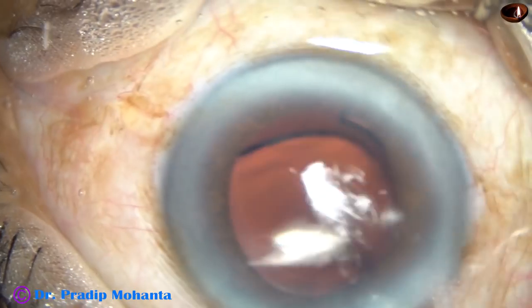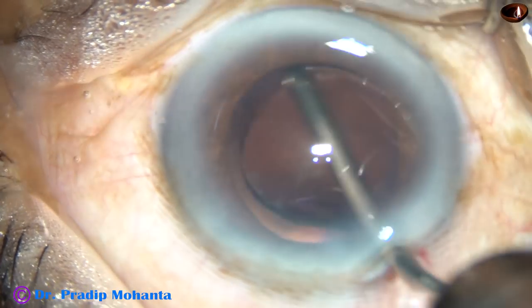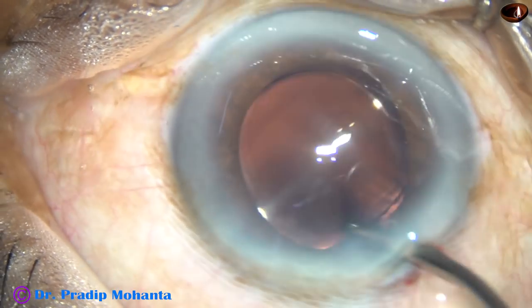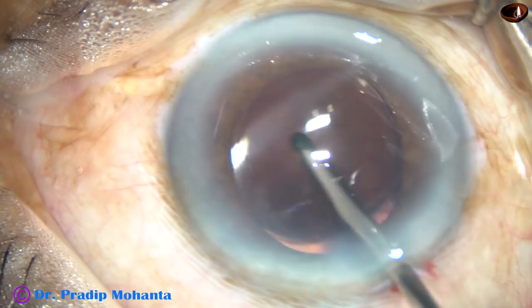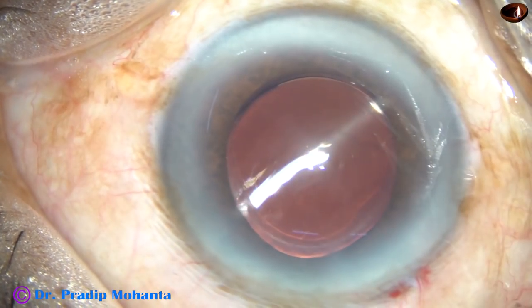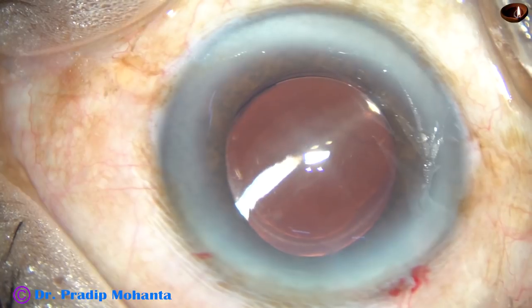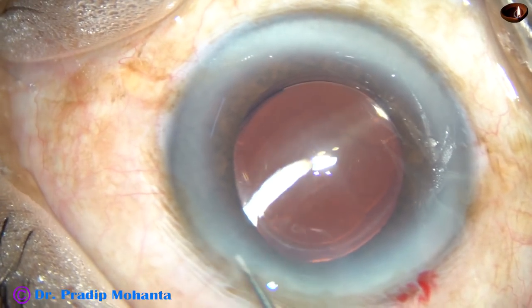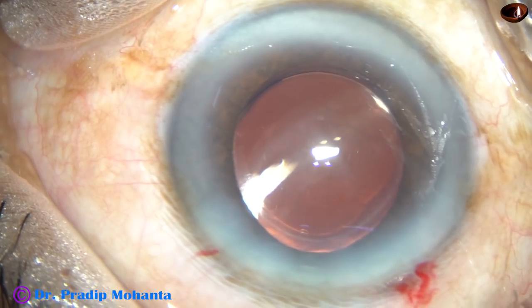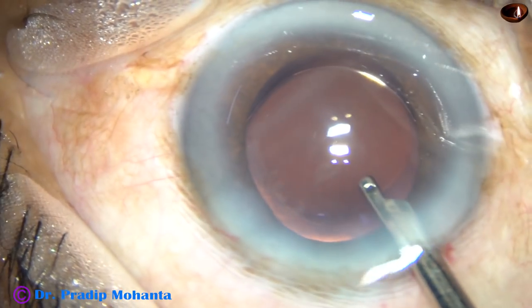Whatever viscoelastic was in the lumen of the cartridge is irrigated out using the irrigating probe of bimanual IA. The lens is dialed by the irrigating probe itself, and the capsular bag is also irrigated. A little bit of moxifloxacin is injected into the anterior chamber, and then the corneal stroma on either side of the stab incision is hydrated so that the paracentesis gets closed.